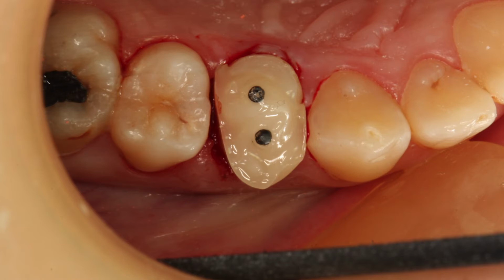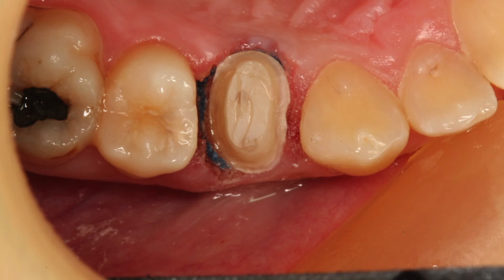Yeah, this tooth is still compromised despite you doing your best to reinforce it as much as possible, but certainly compared to a virgin tooth or just a regular tooth with a crown on it, we need all the help we can get here. So you've got the matrix band off here, and of course that distal open contact actually helps us. We're going to be breaking this contact anyway in just a minute, and there we go. Another gorgeous prep from you.